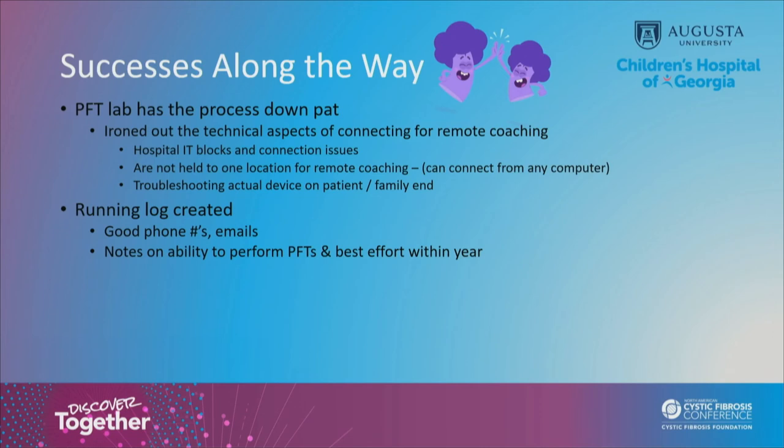They have an Excel spreadsheet that has notes on this particular patient's ability to perform PFTs. So if their blast out has never been good, that is noted so that when they do the next remote coaching, they know exactly where to pinpoint. And they can say, oh, this is a repeated problem. Remember last time we worked on whatever.